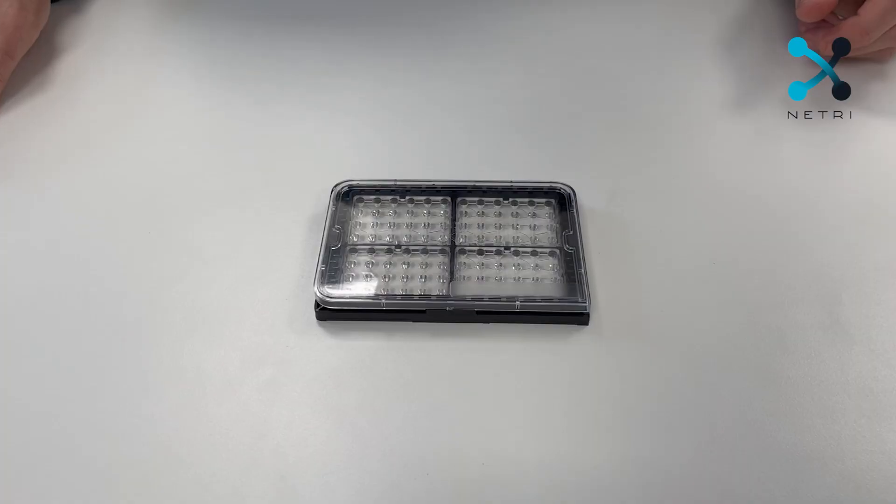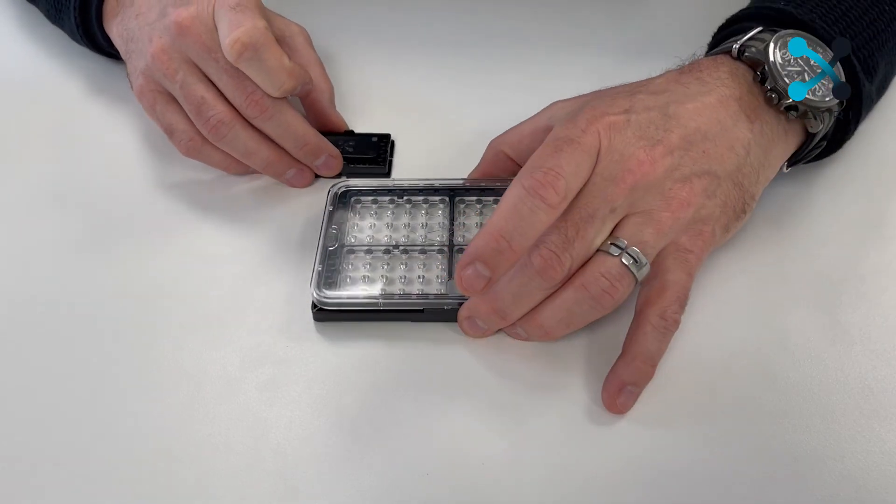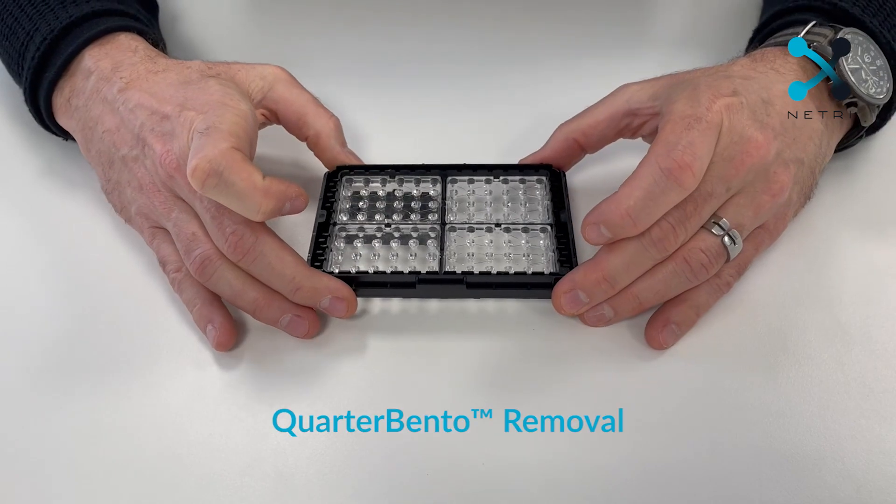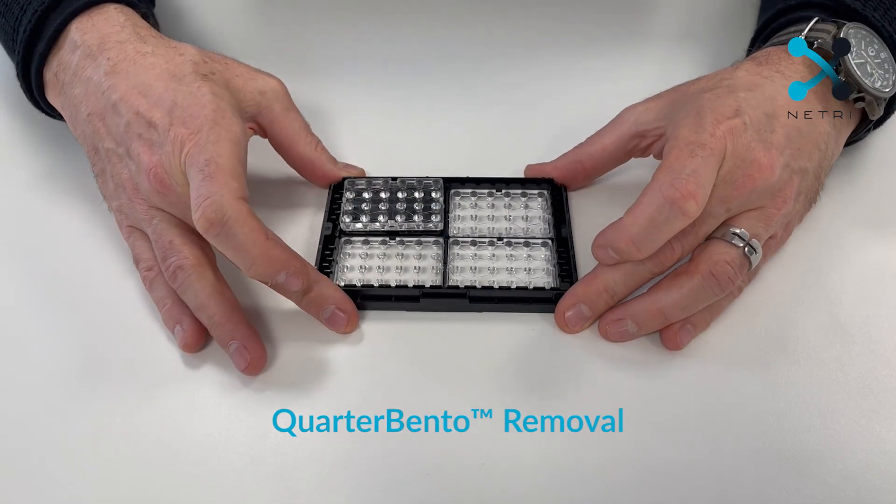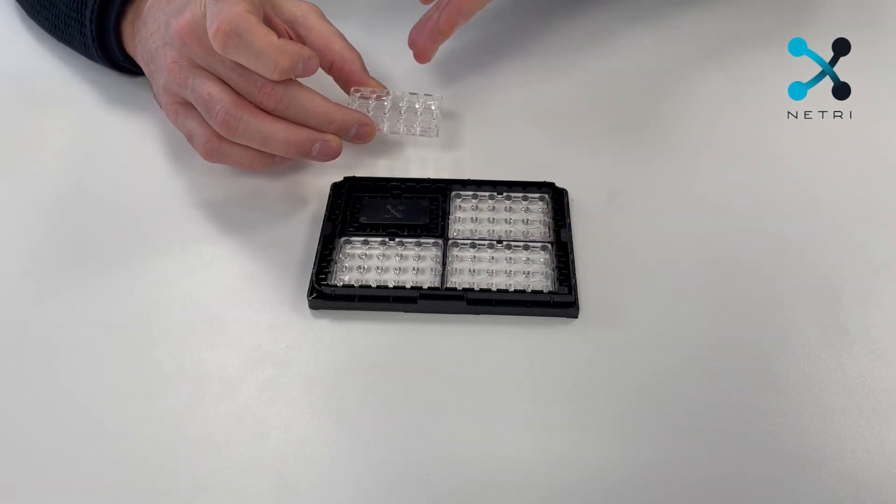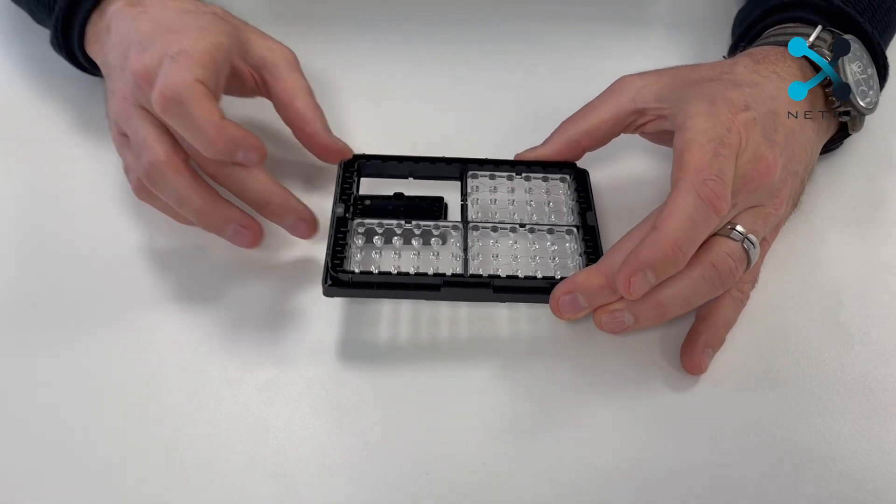Fourth, the NeuroBento allows you to individually remove QuarterBentos using what we call a plug. So you put the plug right under the QuarterBento you wish to remove and gently push it through. This allows you to remove your QuarterBento and go punch it, slice it, do what you want with it without disrupting the rest of the culture because that plug can actually take your QuarterBento's place.